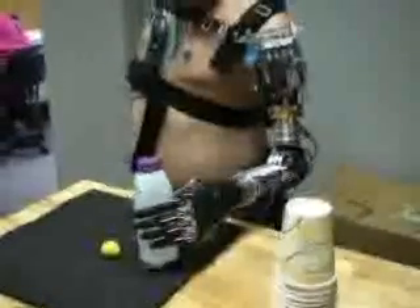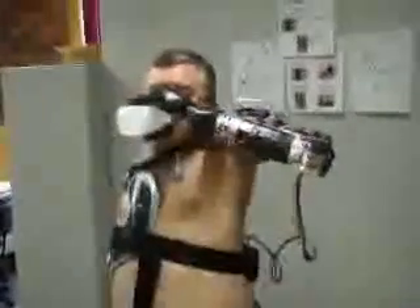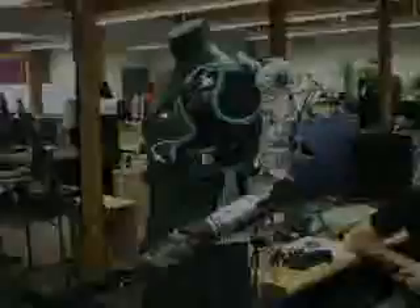Weight is another big challenge in making a prosthetic practical. You have to make an arm that is anatomically correct and then make it weigh as little as possible. Engineers modeled the Luke arm on an average female arm. This particular arm weighs less than eight pounds, including all the electronics and the battery.